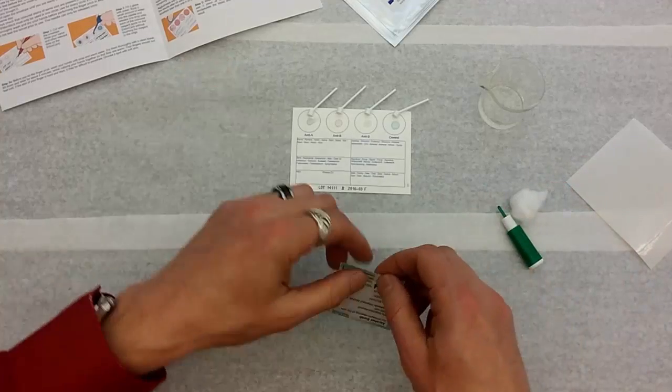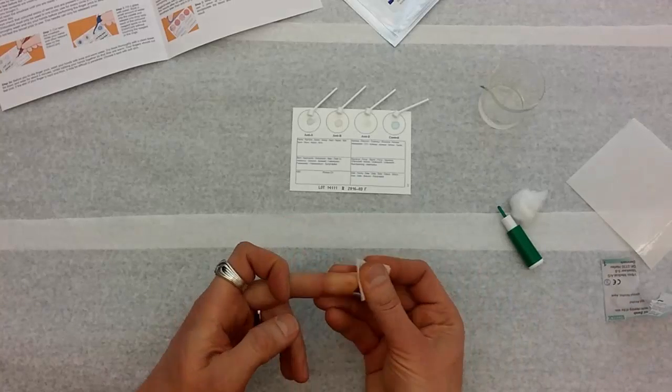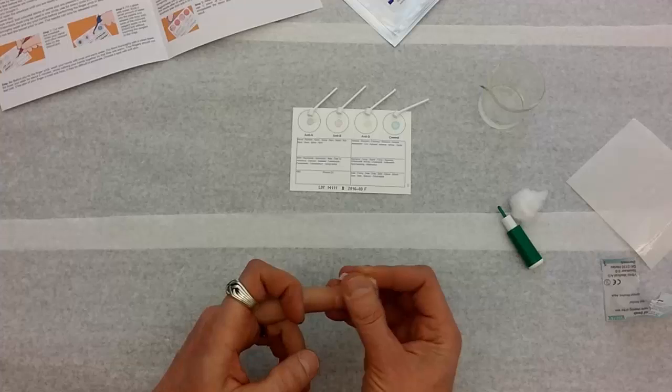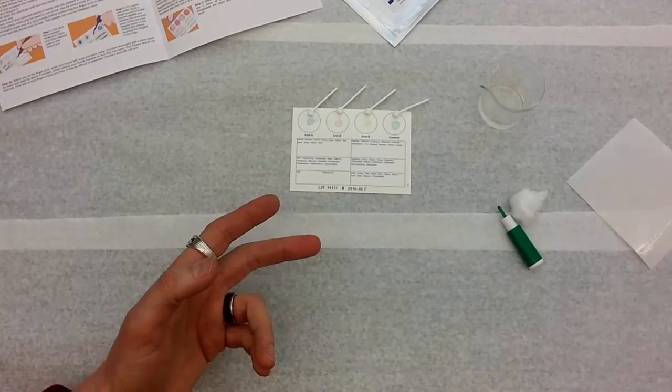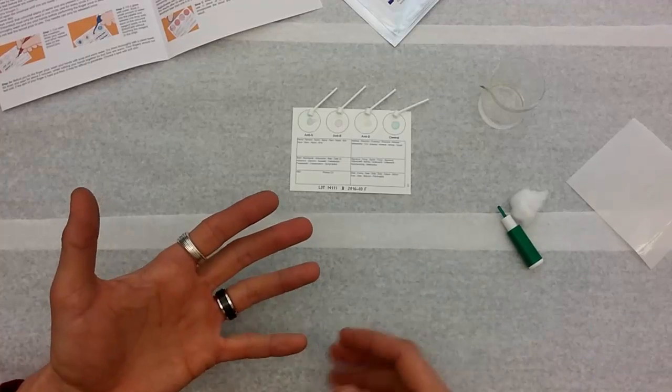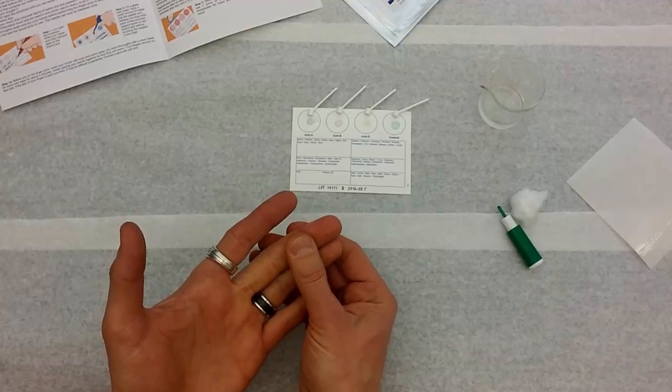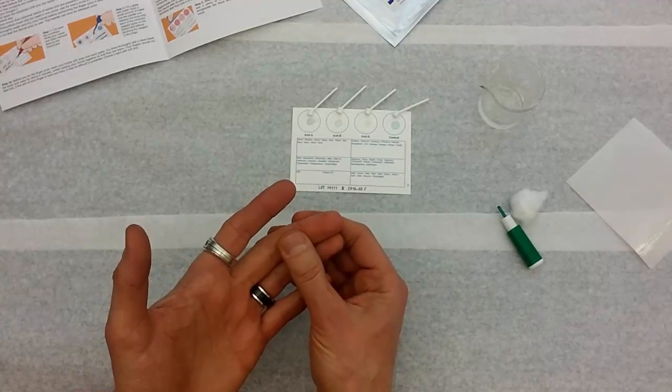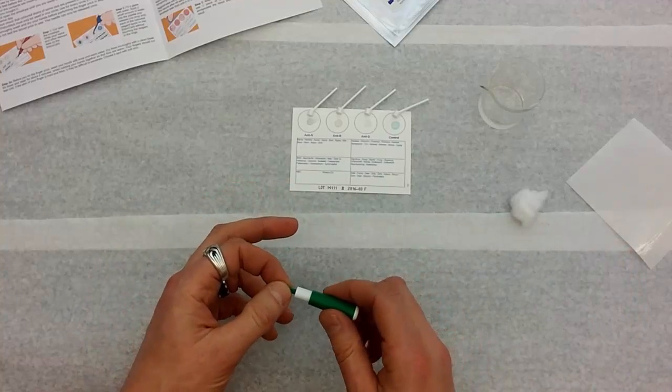I'm ready to poke my finger but first I have to clean it. So a little alcohol pad to clean off the finger. I always pick my middle finger. I figure it's the one that swears, it deserves it. I'm going to dry off the alcohol a little bit. One of the things you might want to do, make sure your hands are warm before you do this and make sure that they're good and pink. You've got good blood down there. You don't want to poke and then find out that you can't get any blood.